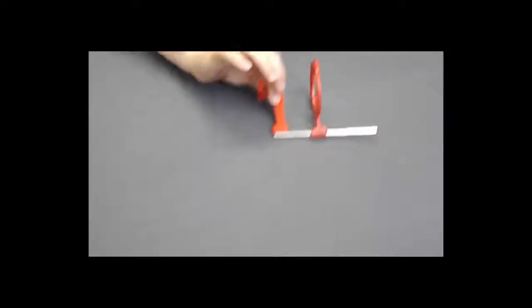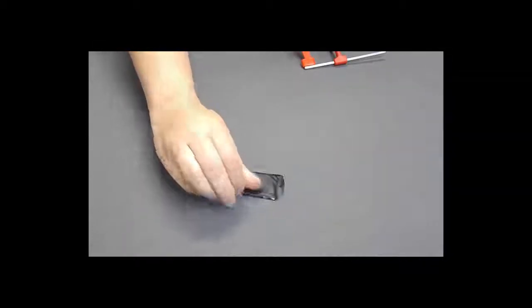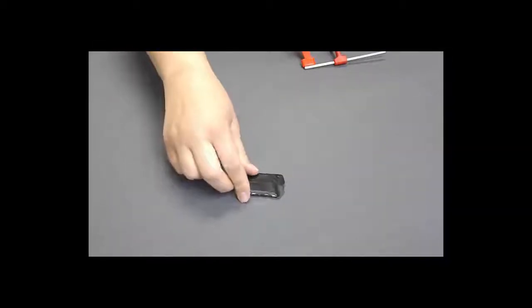You will need a number two size phosphor plate when taking bite wing images. It has a white side and a black side, which is your active side and the side that you would like the radiation to hit.